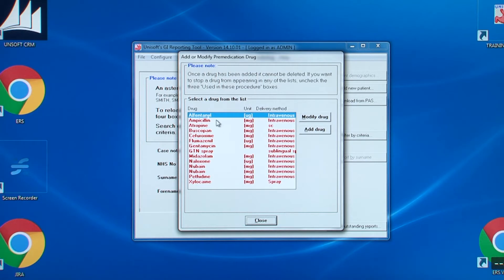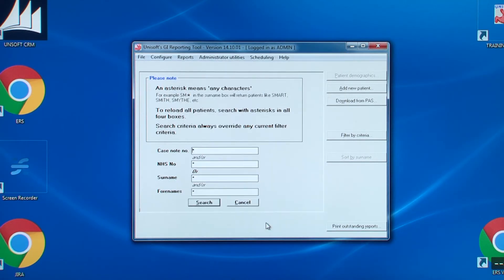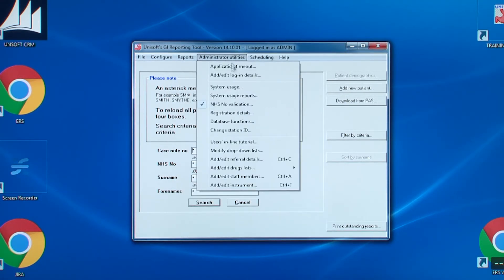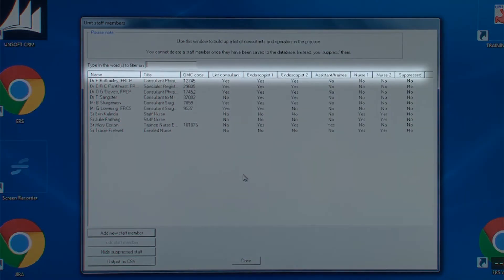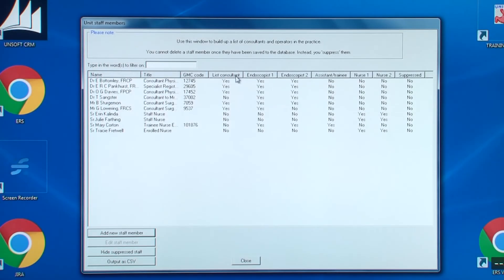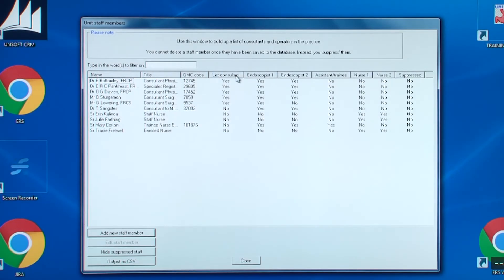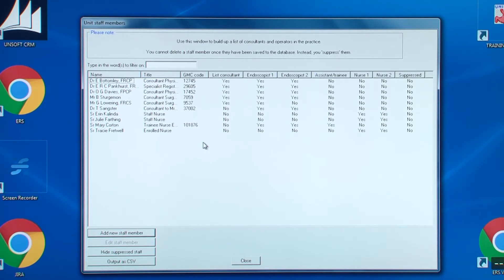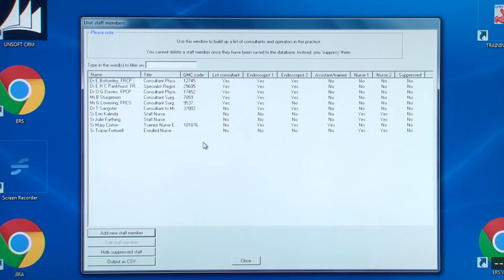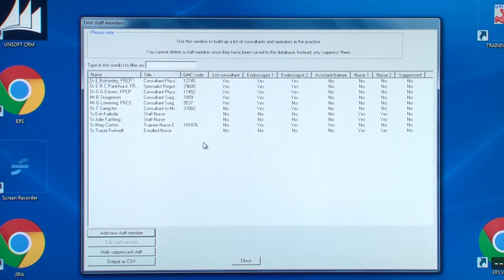We'll close this window and now go to the penultimate entry, add edit staff members. Here's a list of the staff who work and assist in the endoscopies. As with previous screens, you can sort the columns alphabetically by clicking on the column names. Because this is the NED compliant version, GMC numbers are obligatory for all endoscopists and NMC numbers for nurse endoscopists.